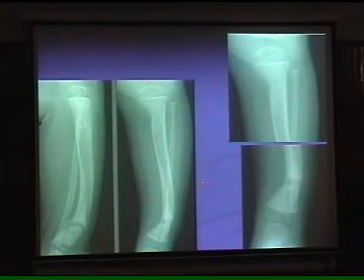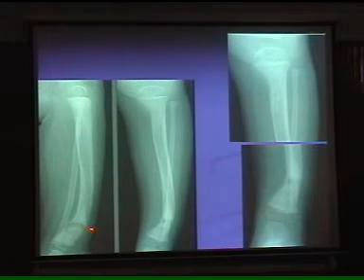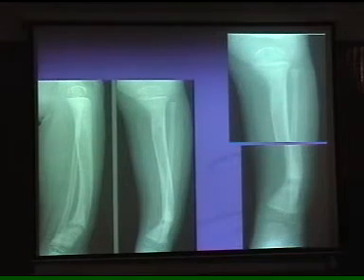Sometimes you can find rickets after the age of 7 or 8 years, and these patients are going to have deformities. Look at the bowing, look at the bone density, the looser lines over there, indicative of rickets. This is known as juvenile rickets, and you can find fractures. And the girls, especially when they have it, get a waddling gait, they can't walk straight. They always lock the knee joints.